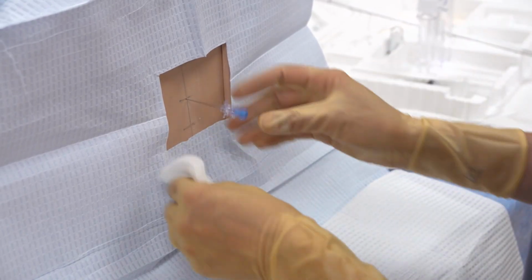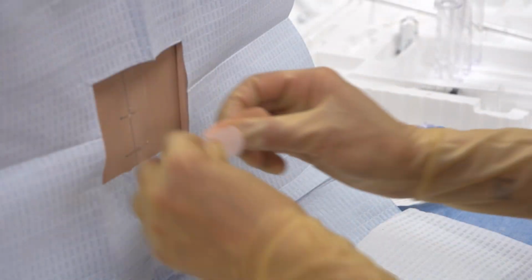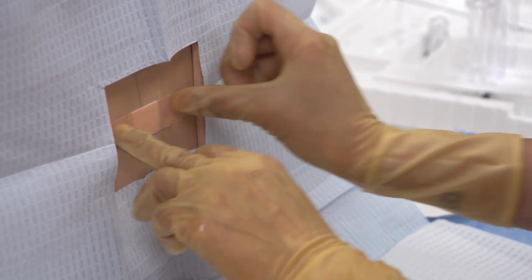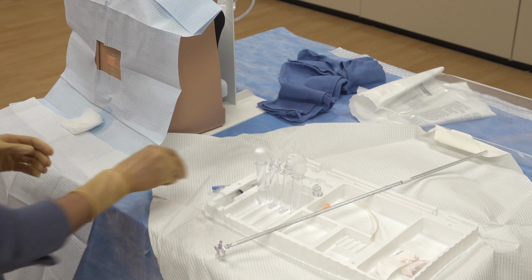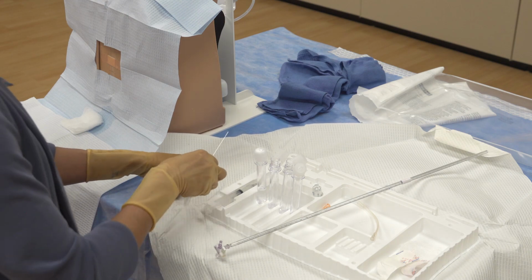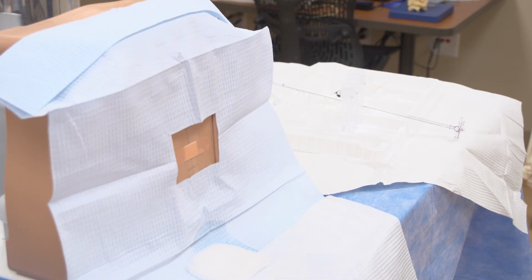Remove the spinal needle with the stylet in place and apply an adhesive bandage. Remember to keep all sharps away from yourself and to dispose of them adequately in the appropriate receptacles. Post-procedural care: we recommend that patients lay supine for 1 hour after the procedure to avoid post-LP headaches. Label all the CSF specimens and take care to closely close the lids.